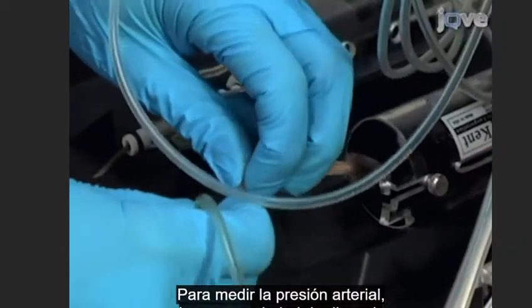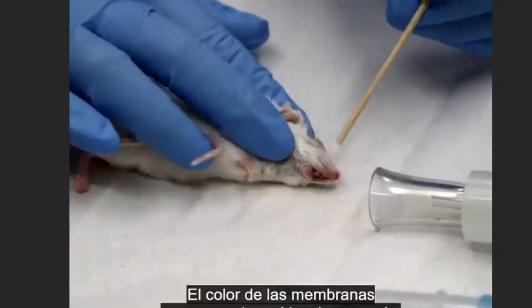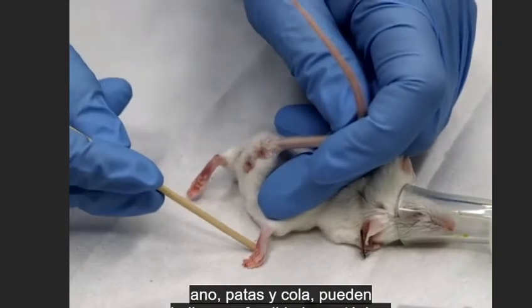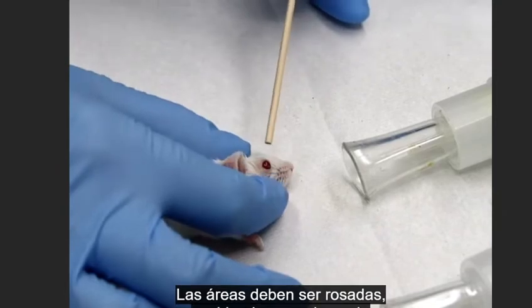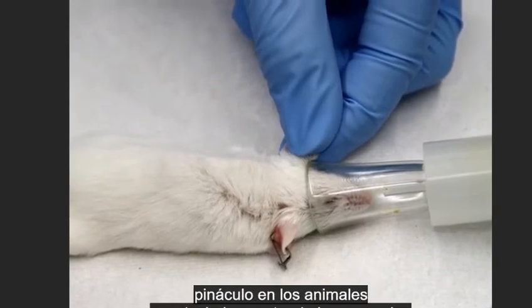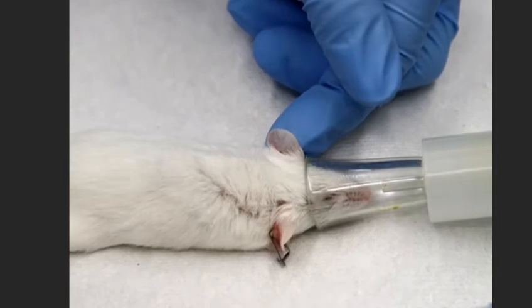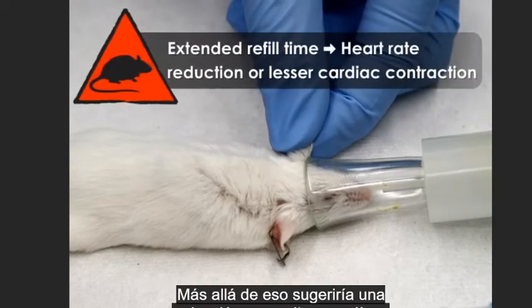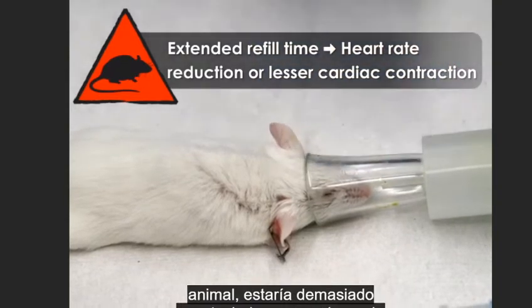For measuring blood pressure, there are a variety of devices that can be fitted over the tail or even over the entire body. The color of mucous membranes — eyes, ears, mouth, nose, anus, paws, and tail — can also indicate anesthetic depth; these areas should be pink, suggesting adequate respiration and heart rate. To check capillary refill time, press on the pinna of the anesthetized animal and count the number of seconds for the blanched area to return to a pink color. This should not be more than one to two seconds; an extended refill time suggests a reduction in heart rate or strength of cardiac contraction, indicating the animal may be too deeply anesthetized and near death.